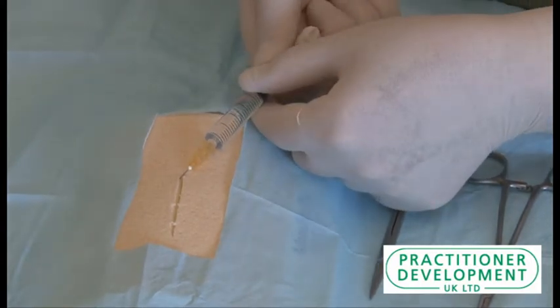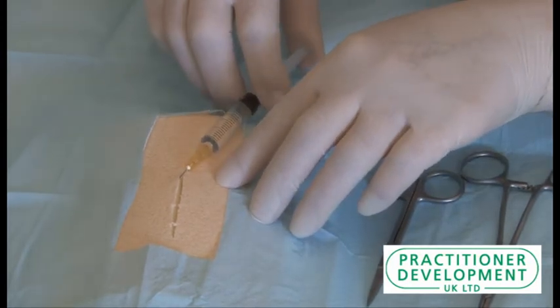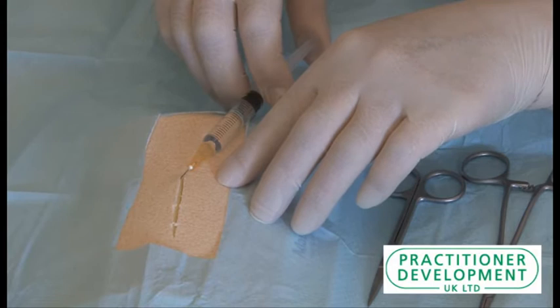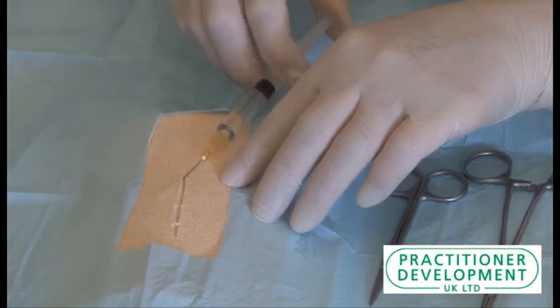We always withdraw to make sure there's no blood, and then we are going to push the plunger and withdraw the needle as we are infiltrating.